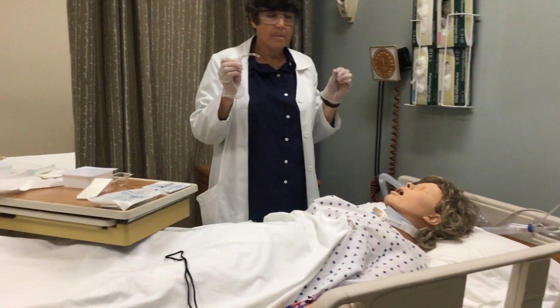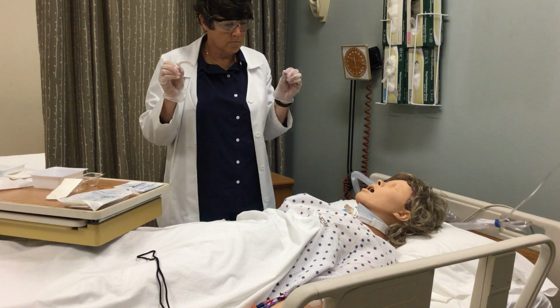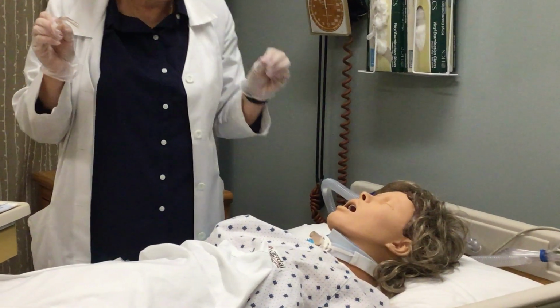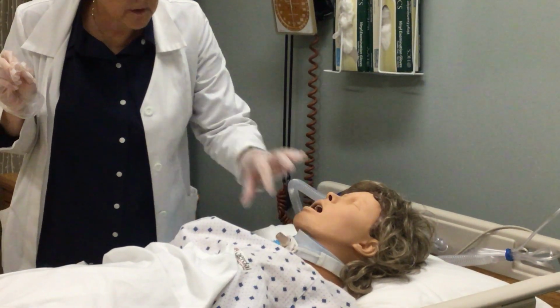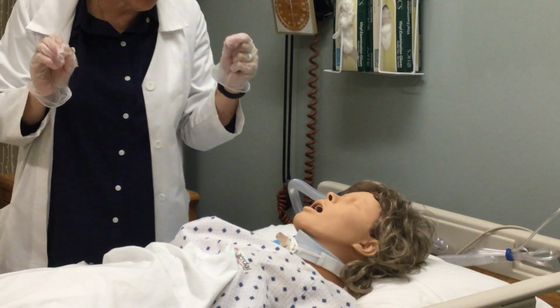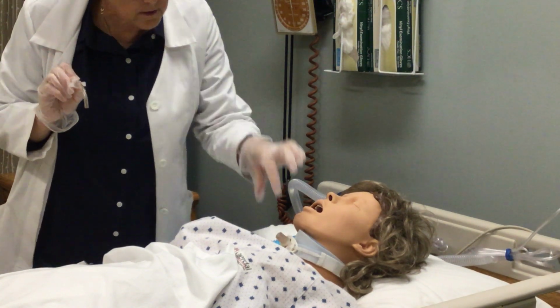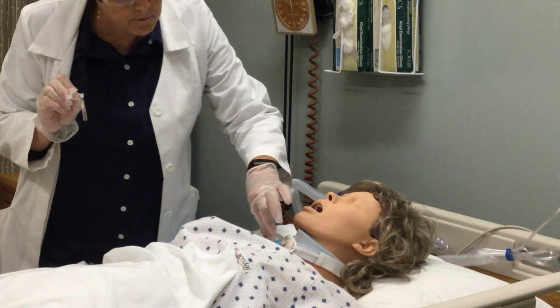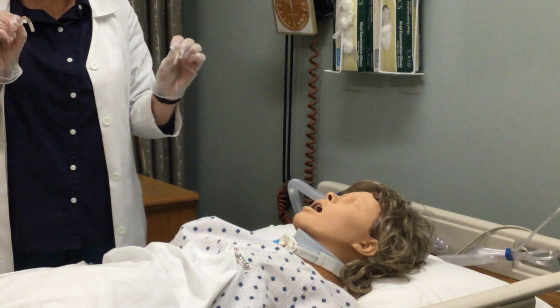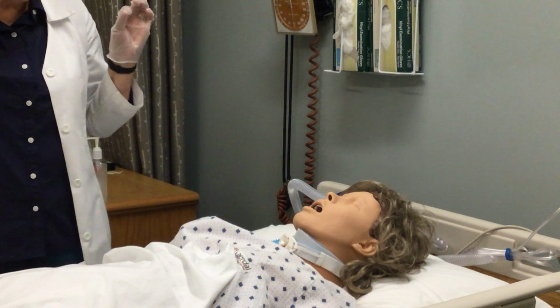While touching only the outside of the tube, withdraw the inner cannula and inspect it for secretions. Dispose of the contaminated cannula in the appropriate receptacle. Okay, so I'm going to use my non-dominant hand for this. And this particular inner cannula, you pinch it like a clothespin or like a chip clip. There are others that have little rings almost like the containers in an orange juice container. This one you just pinch and you remove it. And I'm going to take a look to see what the secretions look like, if there are any. I'm going to use my little disposable bag that I have right here to throw that away.